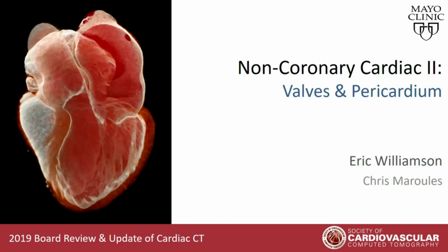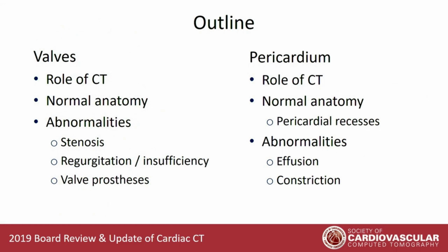And as you can tell from looking at the program for our annual scientific meeting, the program is simply full of lectures talking about structural heart disease. So I want to provide a little bit of a framework for that. As I mentioned, we'll be talking specifically about valvular heart disease assessment with CT, and then also CT of the pericardium.